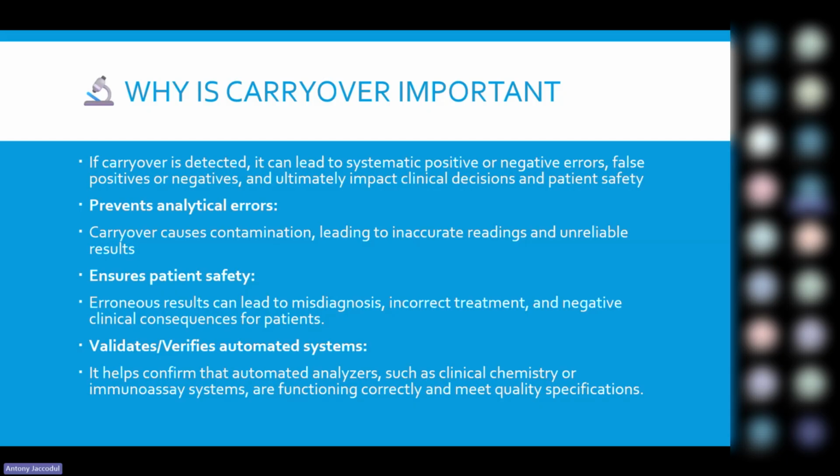This can be heavily impacted also in qualitative tests. When you have a very highly elevated sample X with a high positive, maybe an HIV value, and then you carry it over to the next sample that has no infection, it might cause a false positive in the sample that follows, especially if your analyzer does not have proper washing mechanisms, or the deproteinization process does not really fall into place.